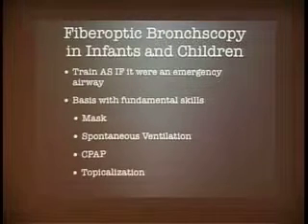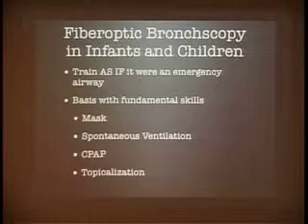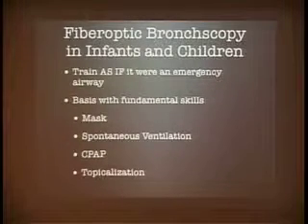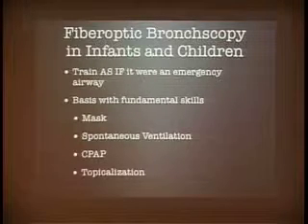Okay. So here's how we do this in adults, and this is how I do this for teaching. What I've done is we have now raised the bar on fiber optic intubation.